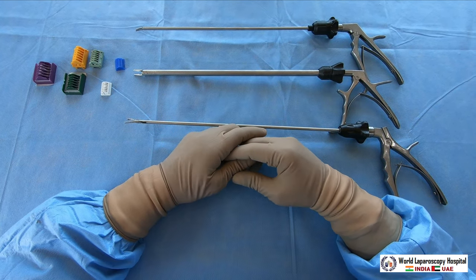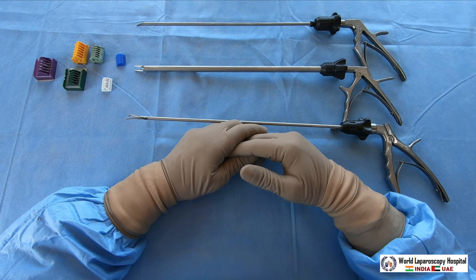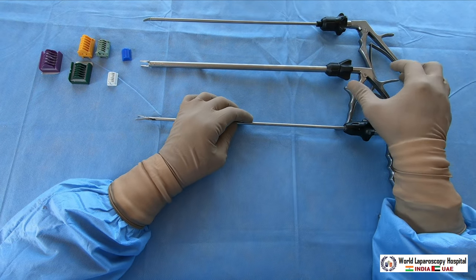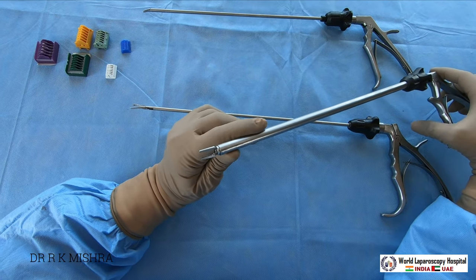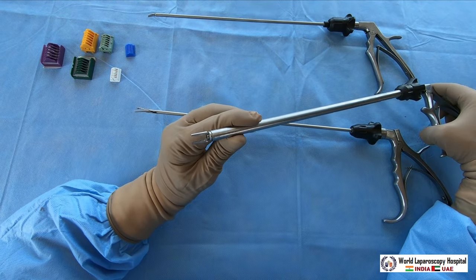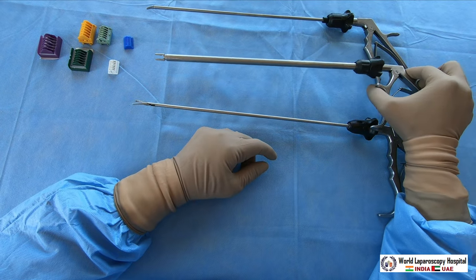Although suturing and knotting is the best method for tissue approximation, clip applicators are also fine — you can use them. There are different types of clip applicators. The first is the titanium clip applicator, which comes in different sizes with different clips available.